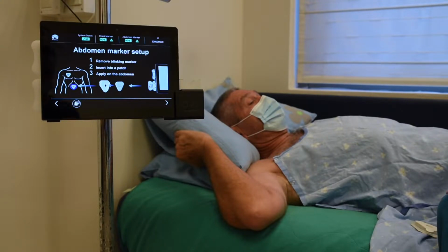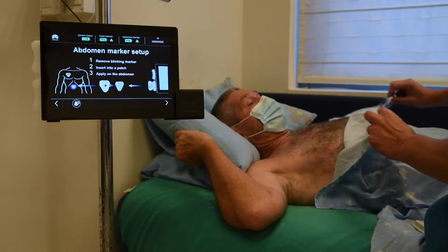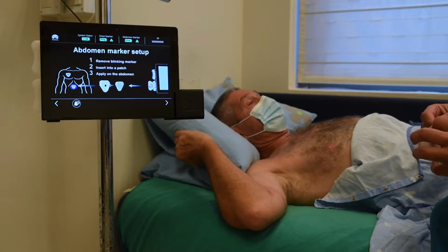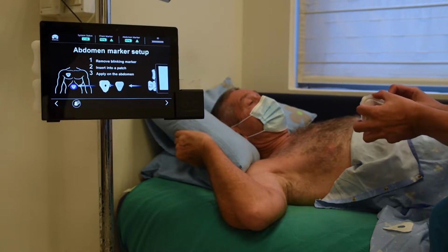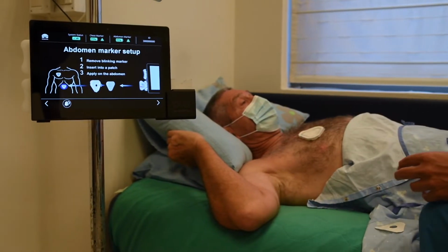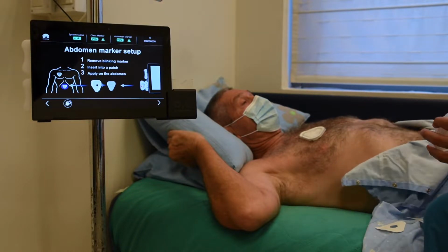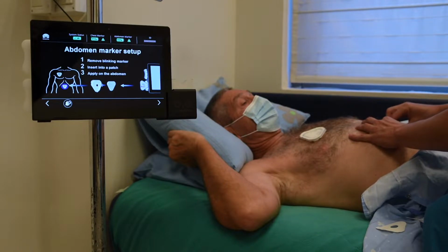Prior to starting to monitor the patient's respiratory function, we need to do two things. The first thing is we need to place the monitors onto the patient's chest. One goes on the right chest, just below the third rib, in a manner like this. And the second one goes just below the epigastrium, just below the xiphisternum. That's the xiphisternum, so we place the second one there.